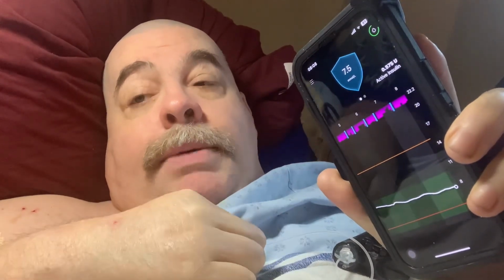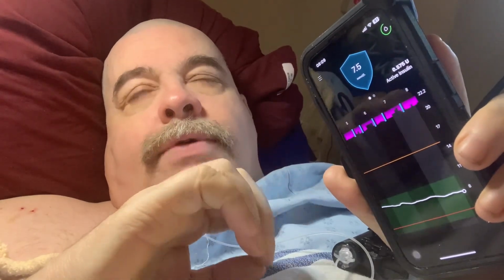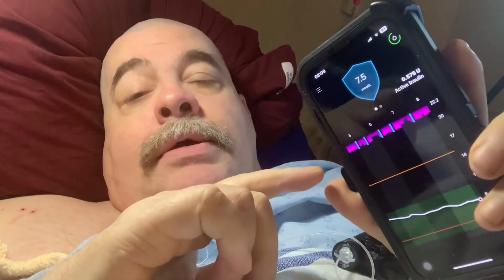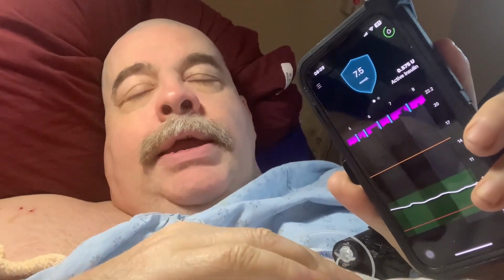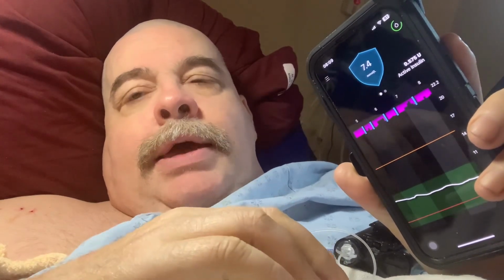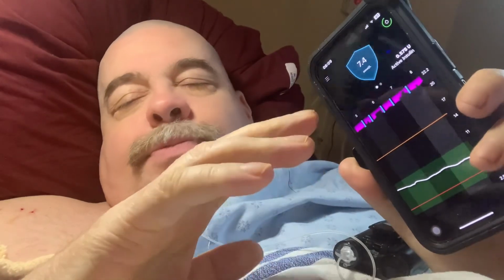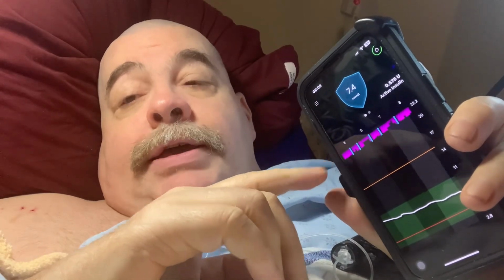The pink on my pump, every pump is different. Every model works differently. Every model of the pumps can work differently. Here we have the basal rate. Now, most pumps, you are set at a certain basal rate. And from, I don't know, from midnight to 3 a.m., you're on one unit. And from 3 to 9, you're on 6 units. I'm just pulling numbers, but this one automatically modifies.